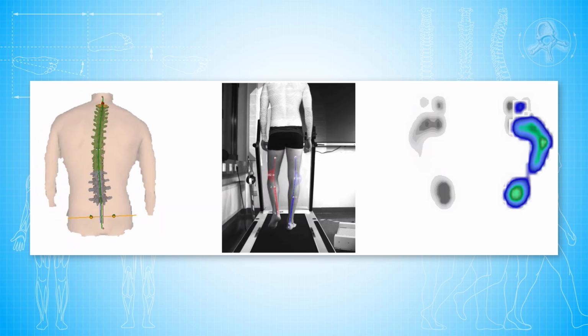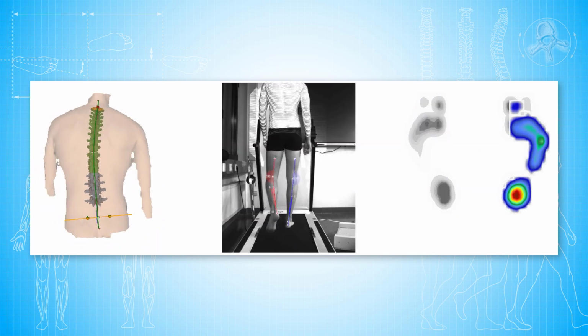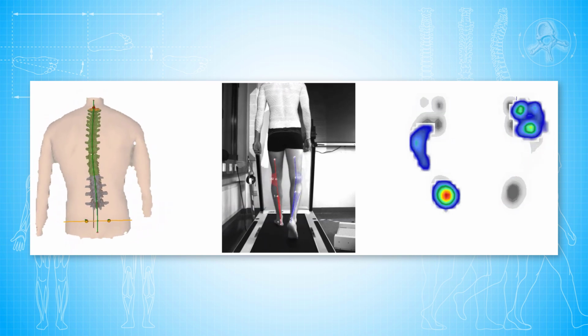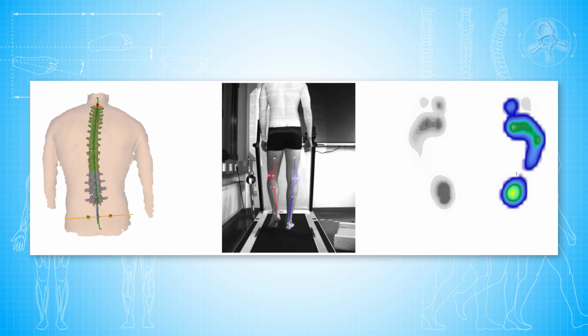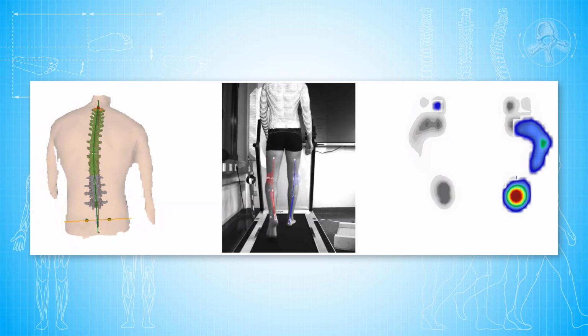When the patient shows a calm and harmonious gait pattern, the fingertips can slowly be released again and the arms can be set in motion. As soon as the arms swing in rhythm with the stride and the gait is not exclusively characterized by acceleration and deceleration phases, we are ready for takeoff and the recording can start. The calculated result data should now reflect the habitual gait in the best possible way.